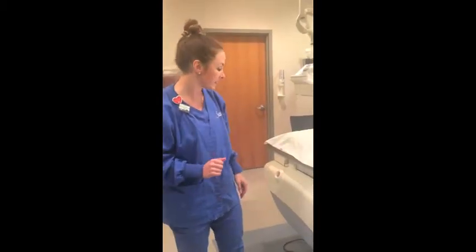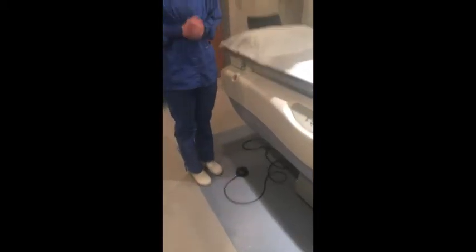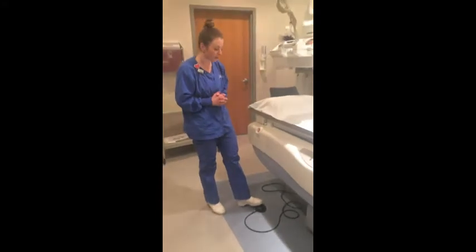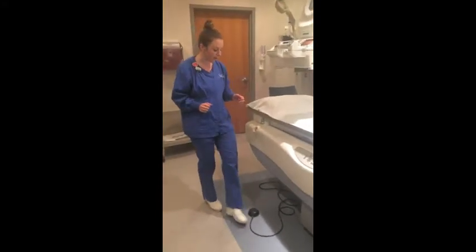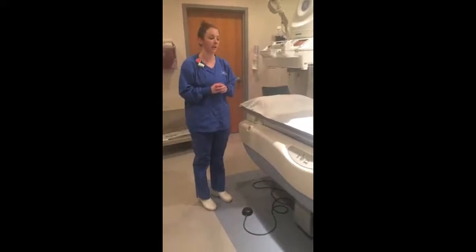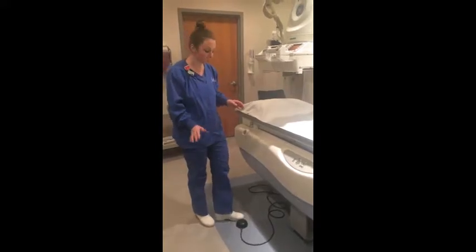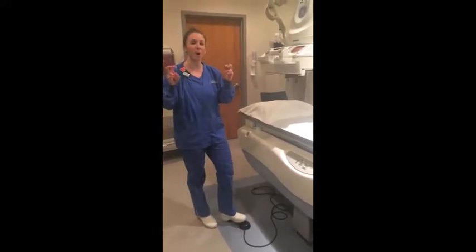Okay, next, there is a dead man switch, which will be used only by the radiologist. It is a foot pedal, so you want to make sure that you bring the foot pedal out and also that you don't step on it in the meantime when you're getting the room set up for the procedure. Okay, so again, that is a dead man switch. This is what pulses the fluoro on and off.